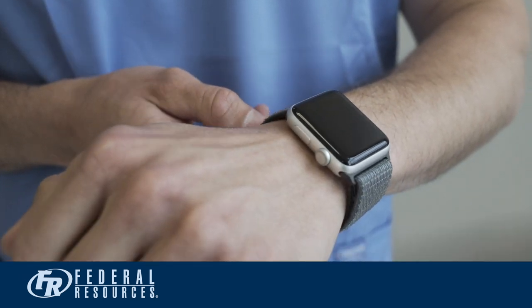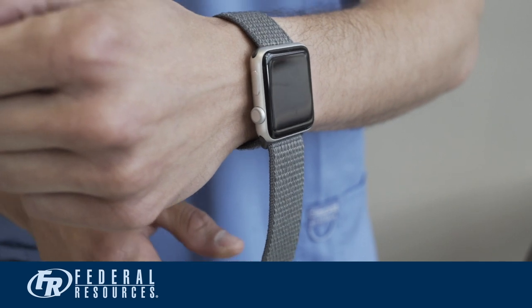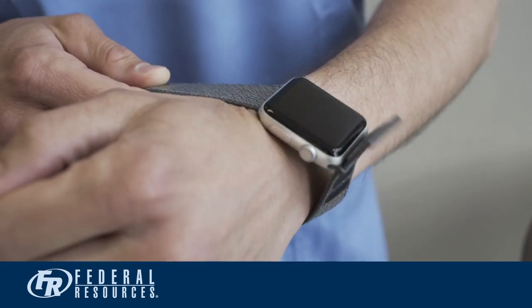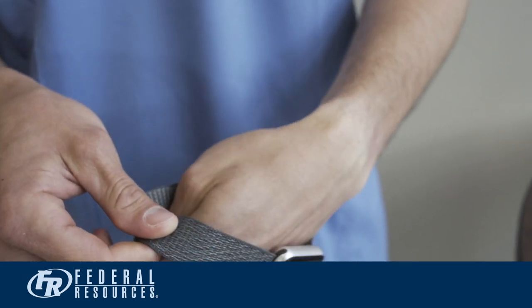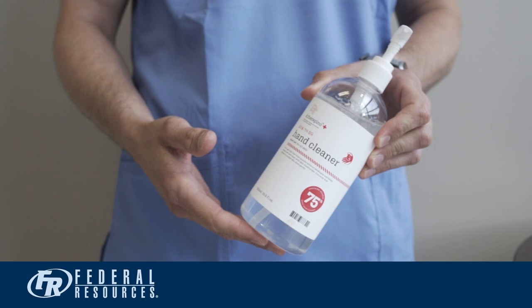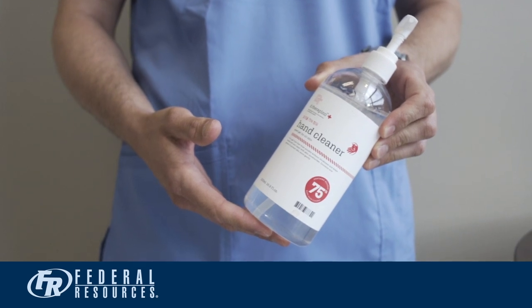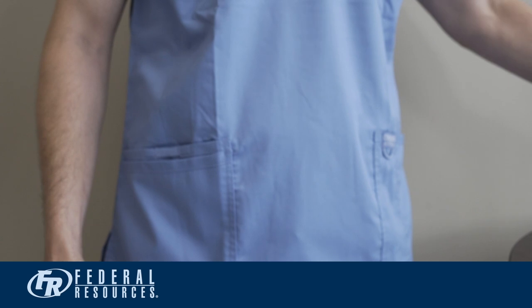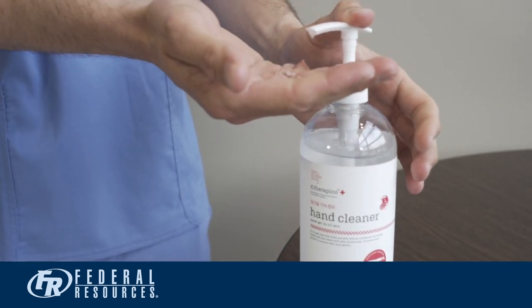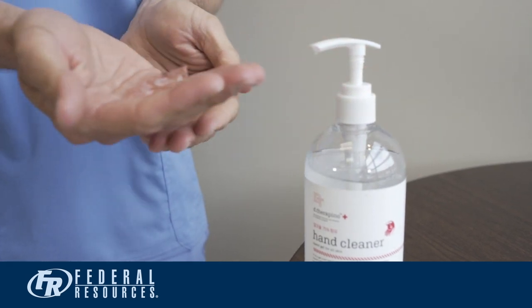You want to think about what you have on your person. If you have any jewelry, such as watches, rings, earrings, or necklaces, you may want to consider taking those off as they can be a nexus for infection. Clean hands using an alcohol-based hand sanitizer. Good hand hygiene is the cornerstone to safely donning and doffing PPE. Use two or three pumps of alcohol-based hand sanitizer. Thorough hand cleaning should take about 20 seconds.